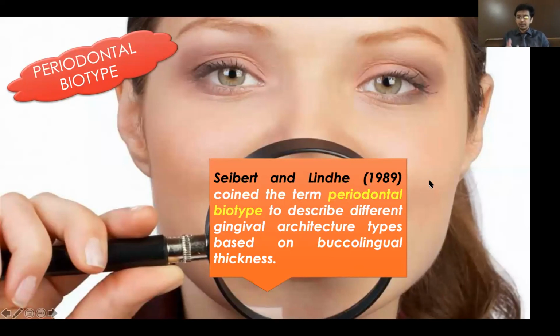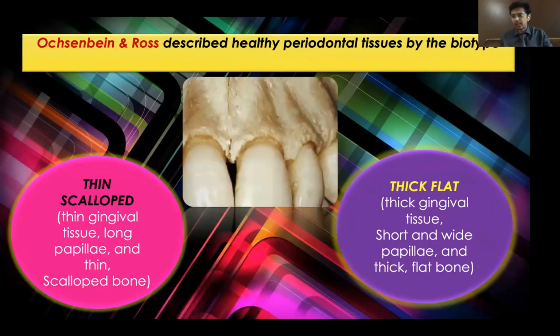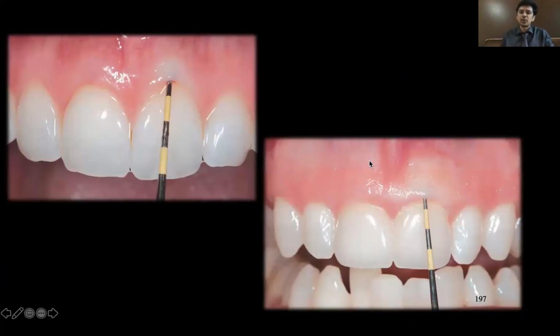You need to be aware of the thickness of the gingival tissues. Are you getting the point? We have two types of thickness: either thin or thick. In the area where the tooth is missing, forget about it. In case immediate implantation is there, you'll have to check how the thickness is. But this is how you demarcate.